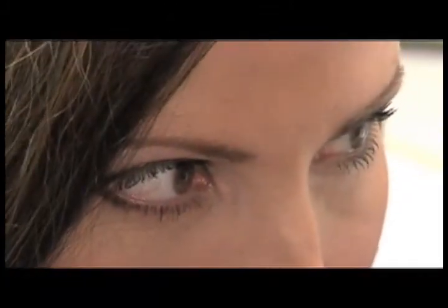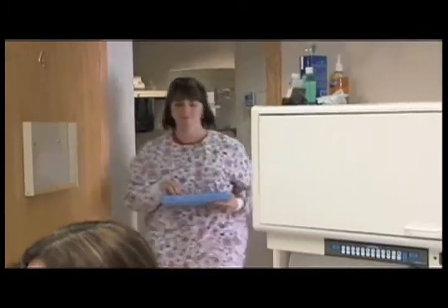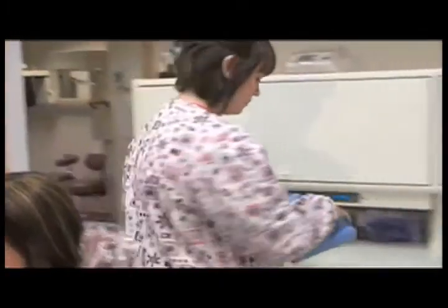But she's worried. Is it going to look like me anymore? Am I going to look like the same person? It will. In fact, in one day, Jennifer will be given a permanent smile. It's not a difficult procedure, and they can have their smile the same day.